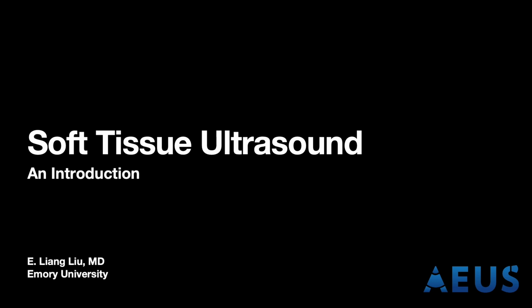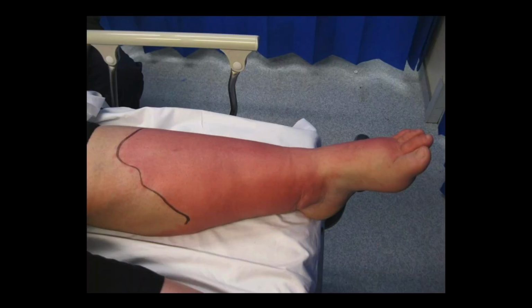Today's talk is an introduction to soft tissue ultrasound. Now, when we see a patient who presents with something like this, there is often no question that this is a soft tissue infection. This is often where ultrasound may not really be necessary, especially if on exam we can tell that this is isolated, superficial, and not associated with any systemic symptoms.